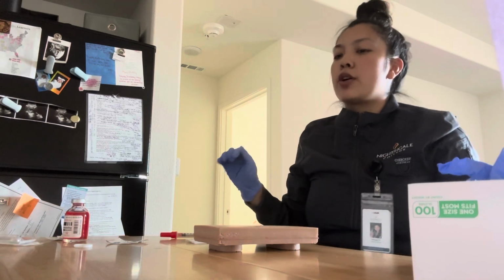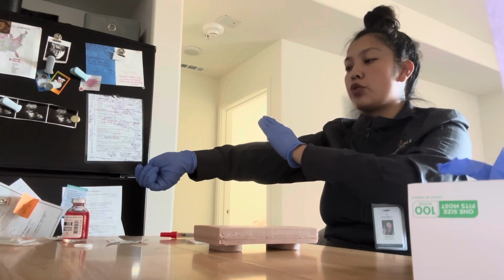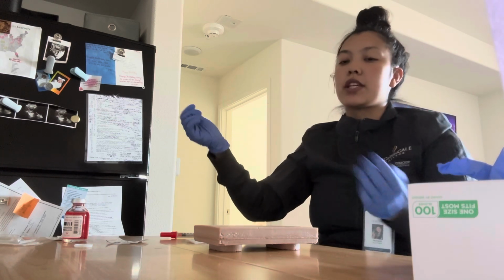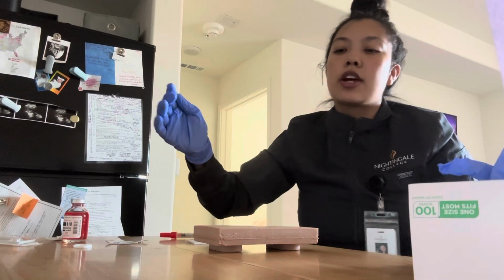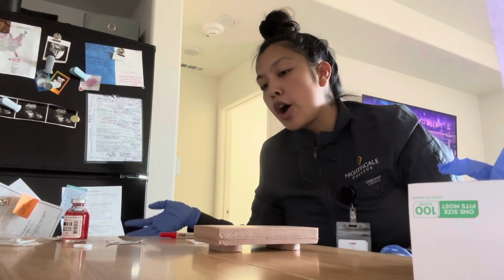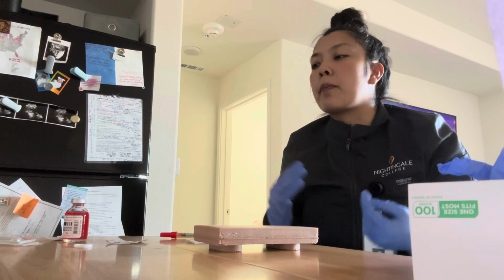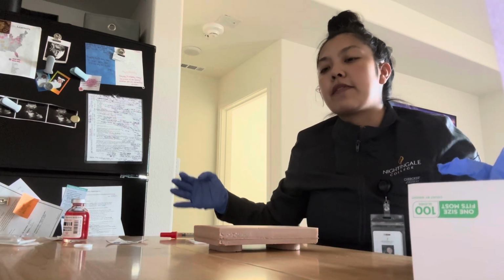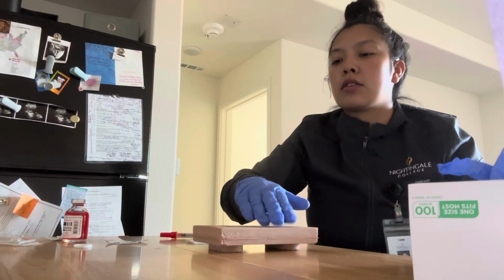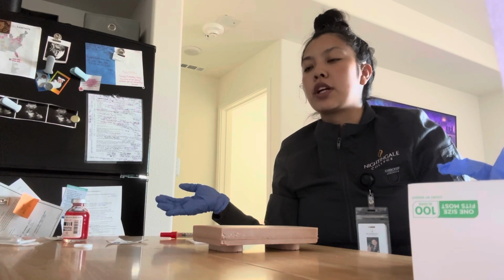Okay. So Ms. Tupo, I have to inject it on your forearm. Your forearm is going to be from 3 fingers below your antecubital space, and then 4 fingers from above your wrist. So I'm gonna go ahead and also check your skin to see if there's any swelling, edema, redness, basically scarring that would not allow me to give you the injection. So I'm gonna go ahead and feel for that. Okay. All good to go. In case that there was something like that, I would try to do the other arm.